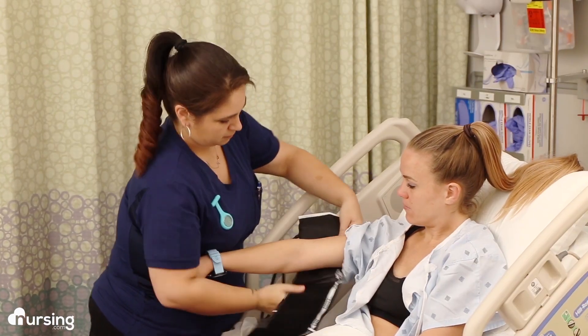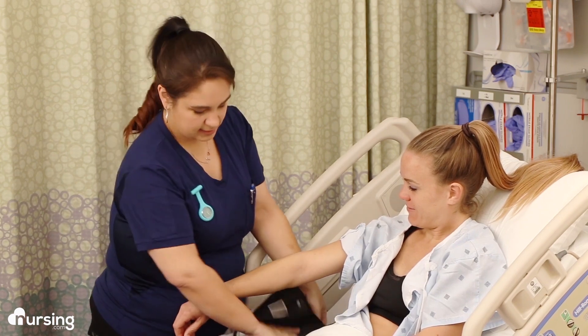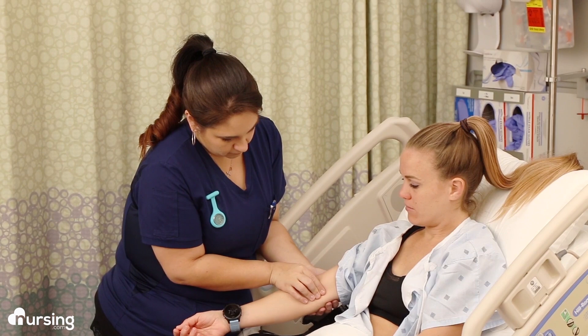First things first: the patient should be upright, legs uncrossed, and arm at heart level. Then you want to make sure you have the right size cuff. Wrap the cuff around their arm and look at the range markings — if you need to, get a different size.